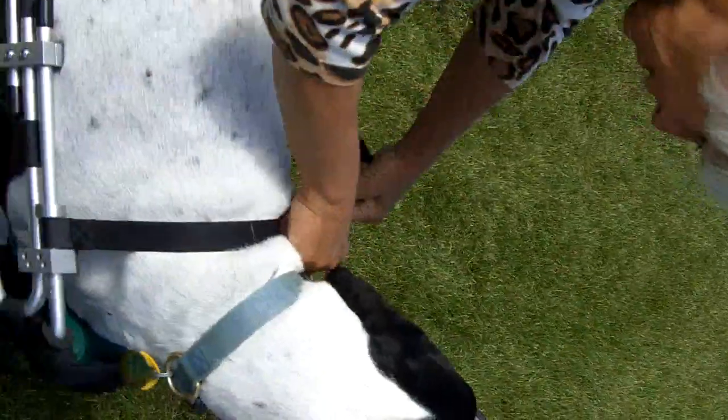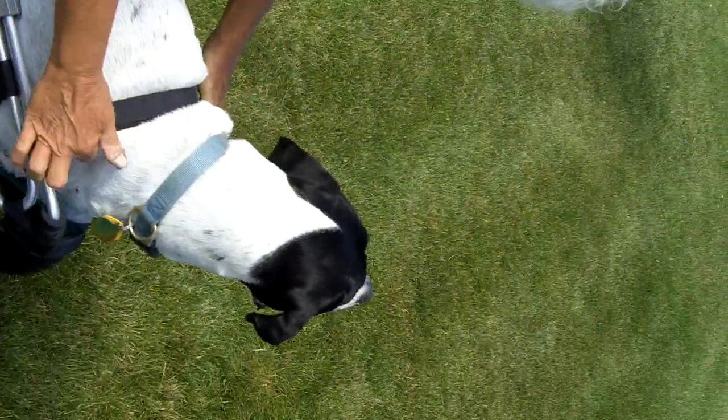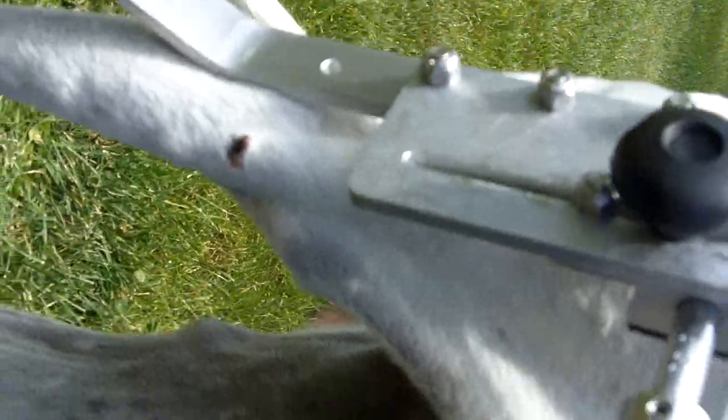Alright, and then of course I have to do this strap, which I can cut yet — I haven't done that. Let's just show how his knees hit here. If we can now put his leash on, then I can show you. You can take the video from the back about how his knees are hitting there.